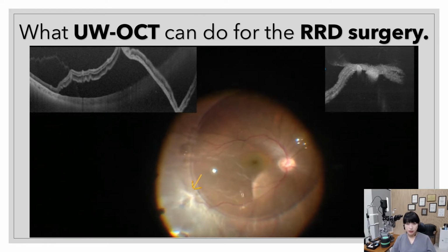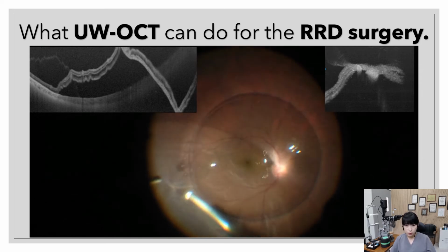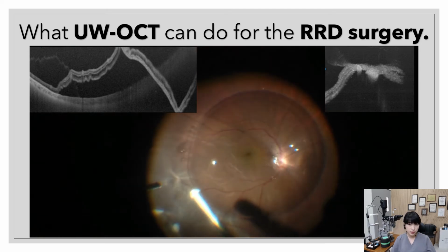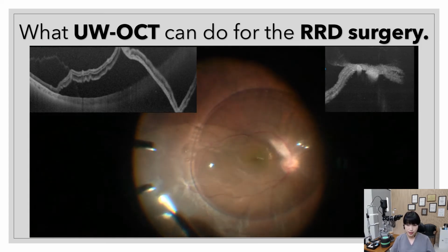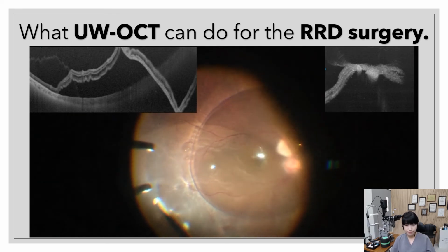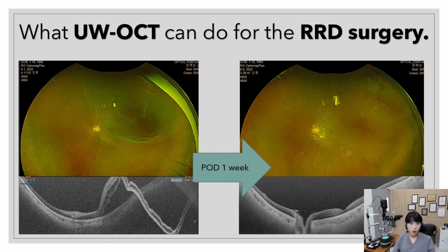And then I checked the area where the vitreous traction was detected in the mid-periphery. You can see that there was remnant posterior hyaloid membrane in this area even after removal of the vitreous cortex. This is quite common, and it is the major cause of recurrence after vitrectomy. He visited for the 1-week follow-up yesterday, and the retina was well attached.